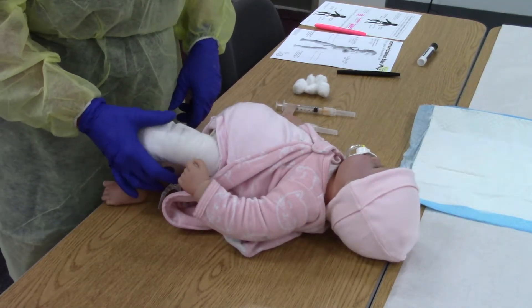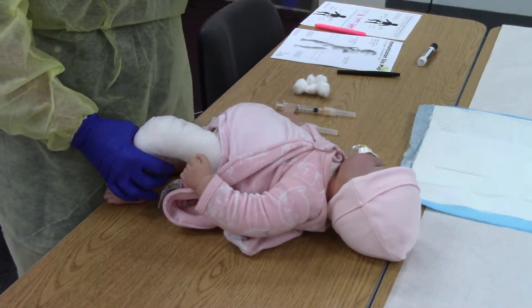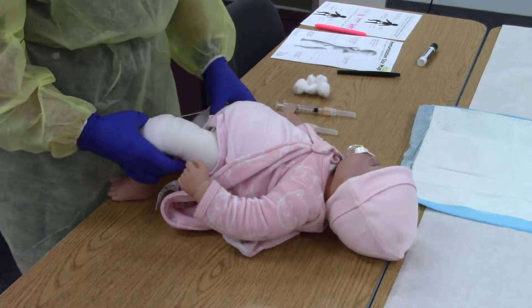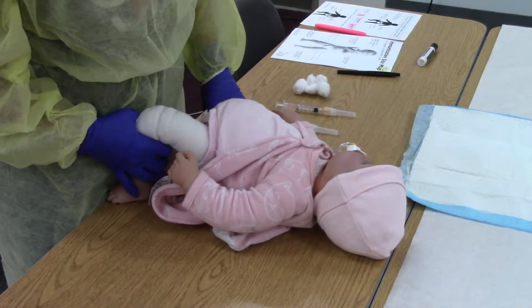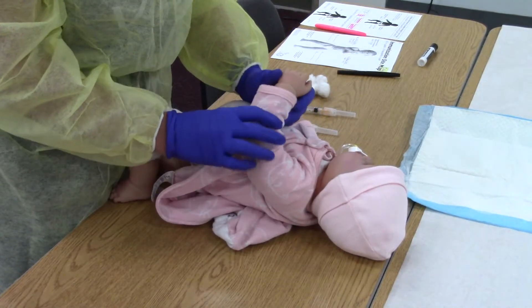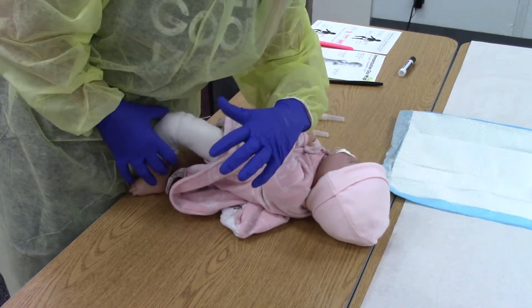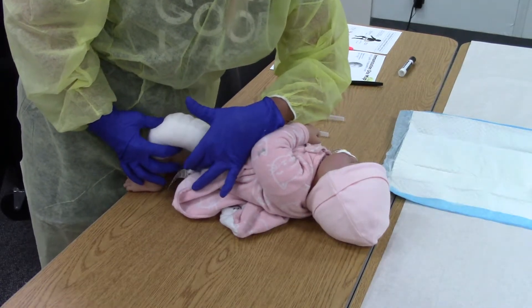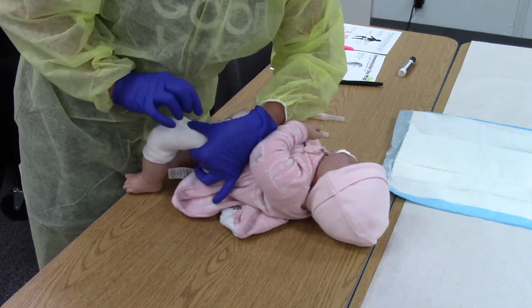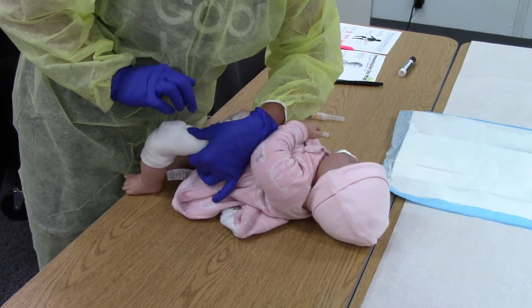For infant vaccine — basic technique to hold the baby yourself if parents don't want to be involved. You need to keep that muscle bent for an intramuscular injection. I use my knee and body to hold the baby's leg at an angle, take the arm over the chest, and apply a little pressure. I put my thumb on the femur to measure and push down so the muscle mass pouches out to the side. My thumb is on the bone because I don't want to hit it.